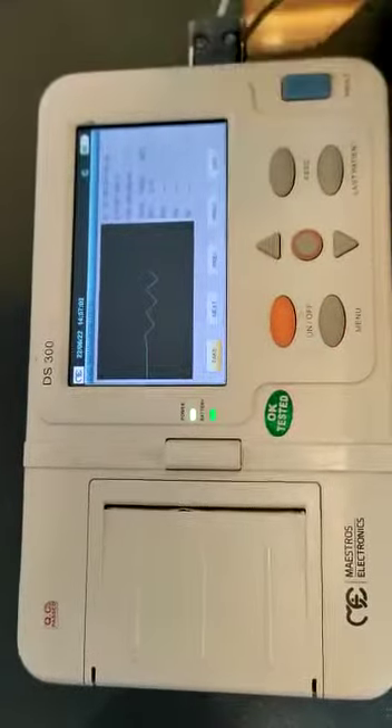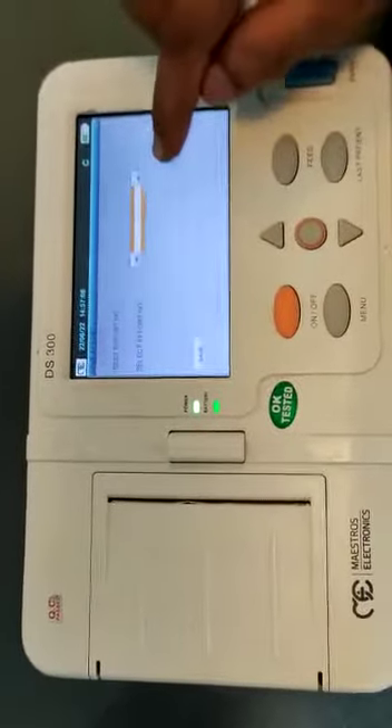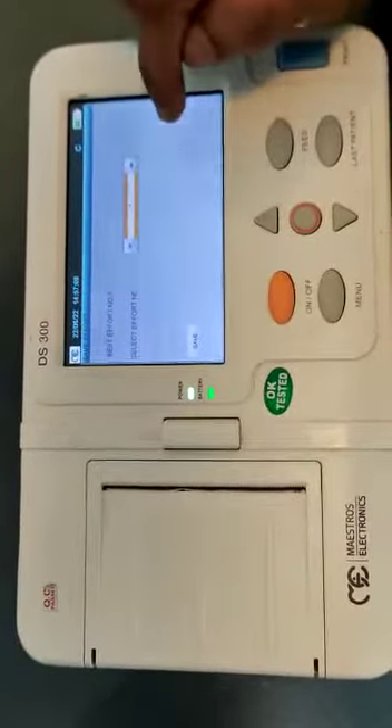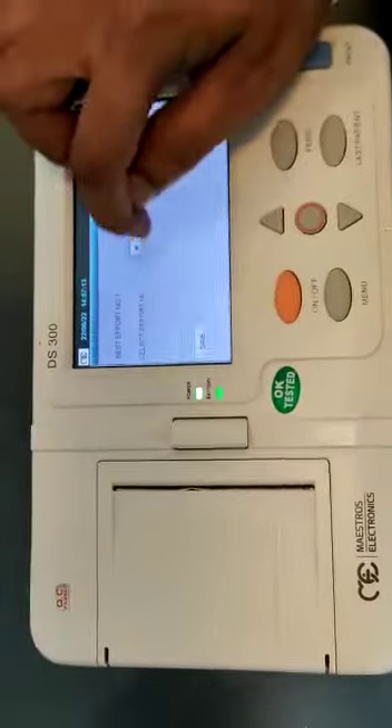Click next and then excel. For MVV and SVC, you have to save the results. Depending upon the effort which you have selected, a maximum of 3 efforts can be taken and saved.